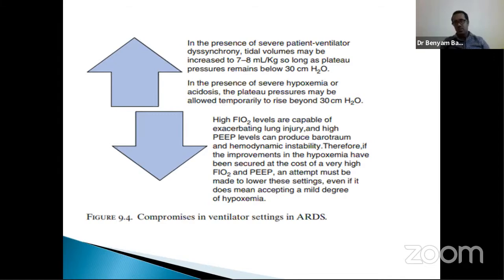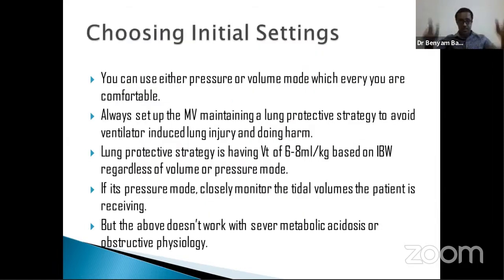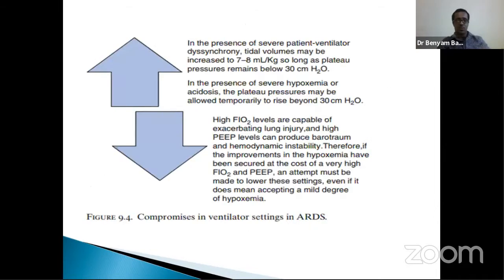So therefore, as long as there is improvement in hypoxia, always titrate the FiO2 and PEEP up or down, and keep them in the acceptable range. So this is a compromise whenever it is ARDS. Keep in mind, whenever choosing initial settings for ARDS, always think of these things: what do we need to compromise, and for how long? Okay.